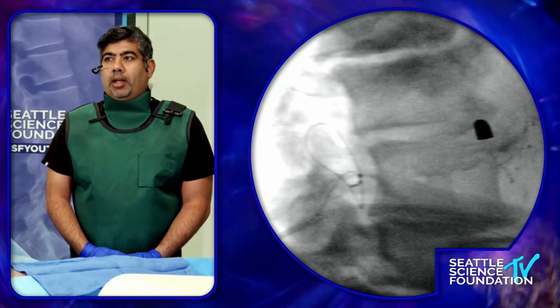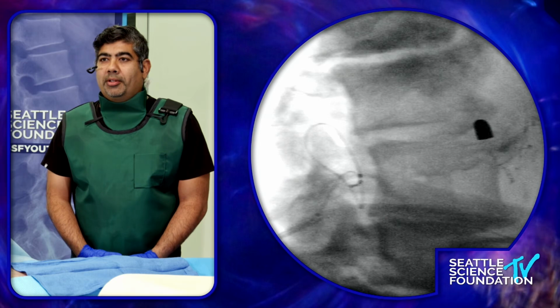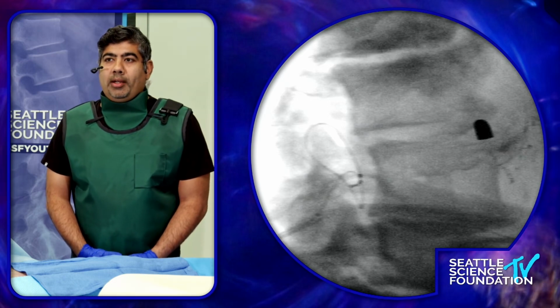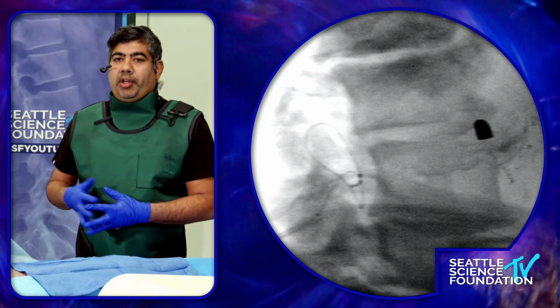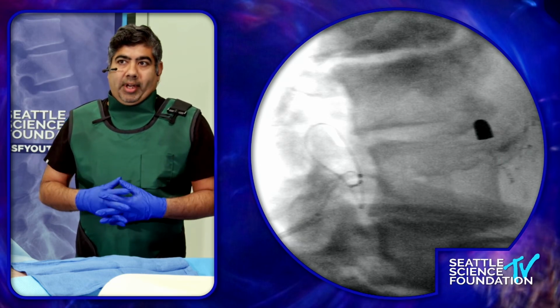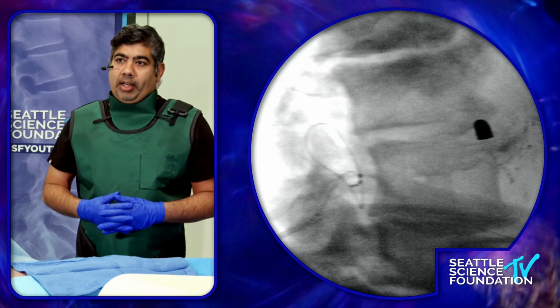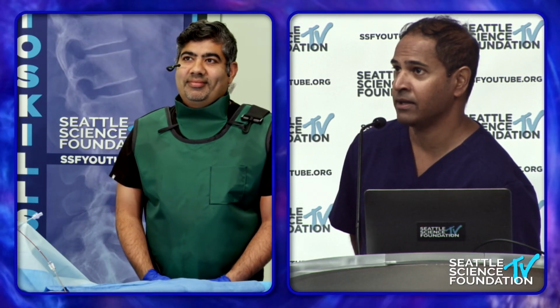Pankaj, how was your lateral? Let's look at it. It's so beautiful. So that's the Cheerios Rama was describing. I think the key is Rama mentioned that as long as you don't cross the posterior border of the vertebral body, that's defined as dorsality in the foraminal space versus the usual dorsality we are used to where the leads are snug, completely posterior in the epidural canal. So you have nice loops. You have the Cheerios turning back, taking the shape of that bony wall of that foraminal cave. And the L4 DRG has been modulated. Well done. That was fantastic placement, better than me.